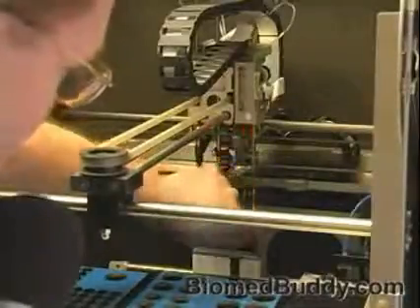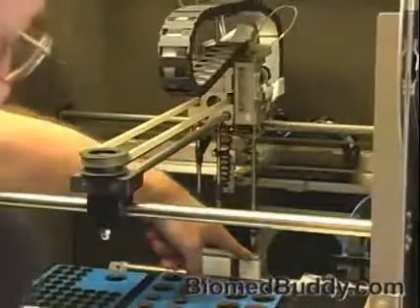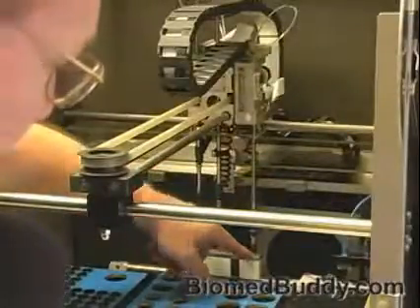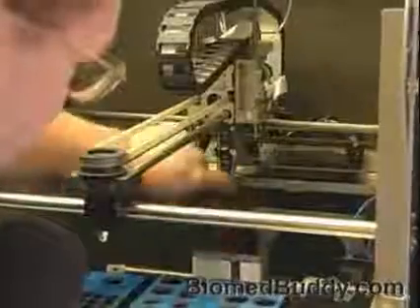By the way, a lot of times what I do when I first come to an instrument is take them and put them all the way down. The reason is that you can tell if a needle has been bent, because in theory this part is all locked in, so it should always be correct, even from one mapping to another, assuming it was mapped correctly the last time.